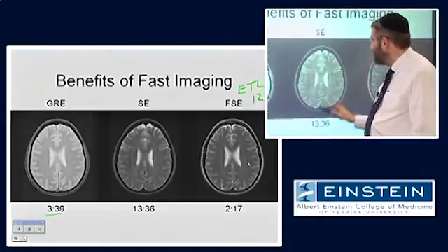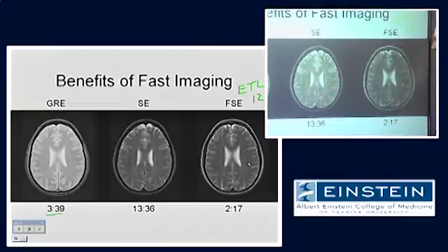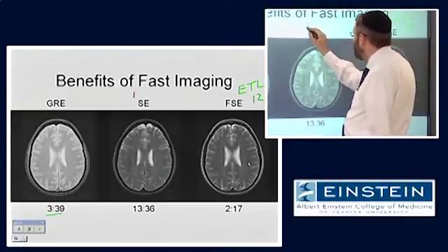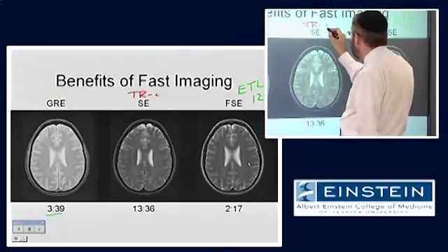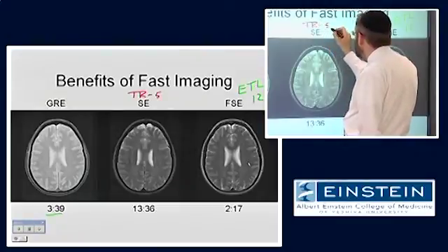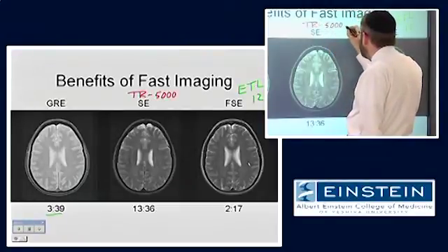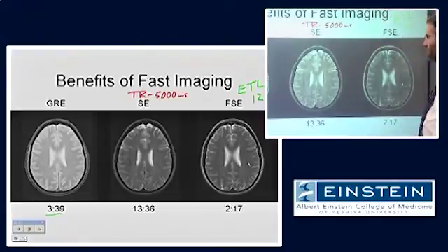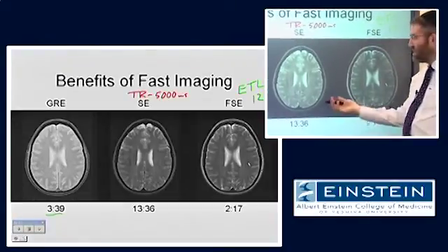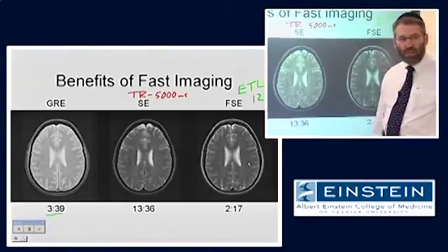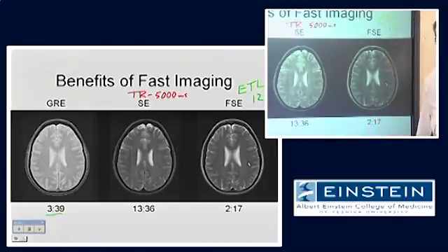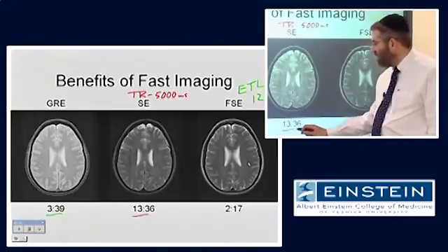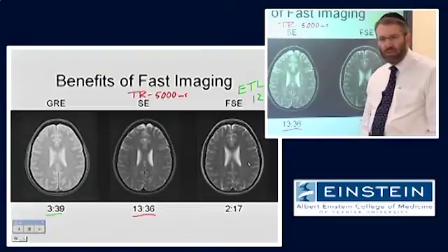This is the T2-weighted spin-echo image. The TR in this case is 5,000 milliseconds. This is standard multi-slice spin-echo imaging, like we looked at before, and it takes a really long time. We don't do this — it was done specifically so I can show you an example of what it looks like.